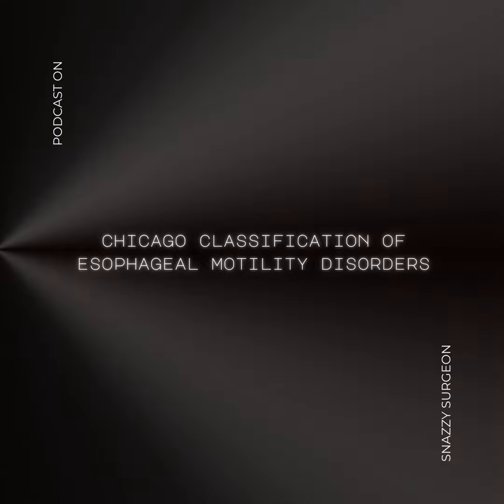What about the contractions in the esophageal body itself? Are they affected too? Interestingly, the esophageal body can actually have either hyperperistalsis, meaning it's overactive, or it can be completely normal. But the real clincher, the thing that confirms it's EGJ outflow obstruction, is that elevated IRP. So elevated IRP is the hallmark.